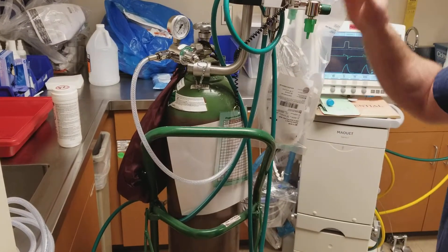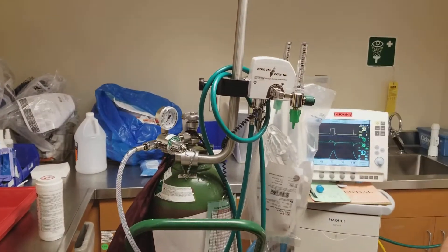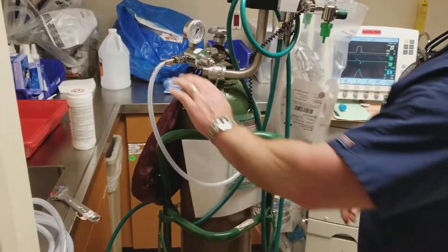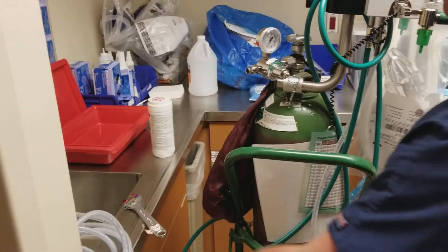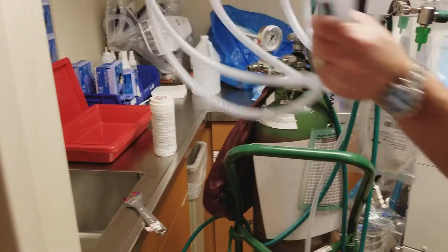To get started, we'll disconnect this from the tank. We'll leave the regulator on, of course — take that off — and now we're ready to hook the hose up.